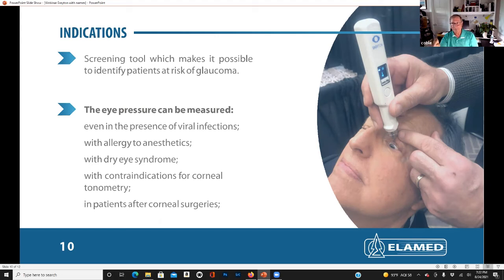And as you look at the eye, I'm taking one finger and pulling the lid up taut, so they're taking the wrinkles out of it, if you will. And I'm looking at the limbus, and you're looking above the limbus at the sclera. So you want about 1 millimeter of the sclera showing, and then you take the Tono-Pen or the EasyTon, and you move it about 1.5 or so millimeters above the lid line, and then you just push it down. It gives you a very fast, quick reading. So that works out extremely well.